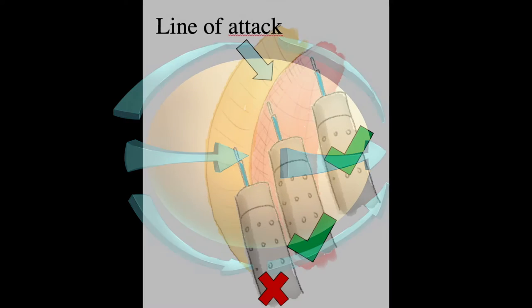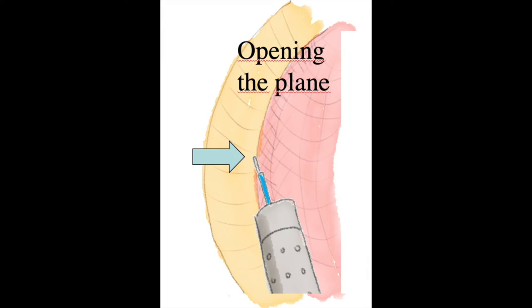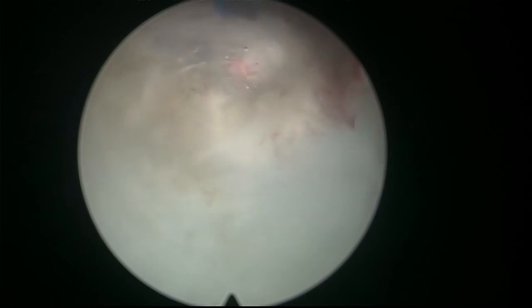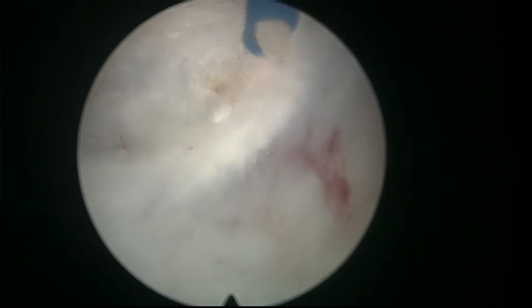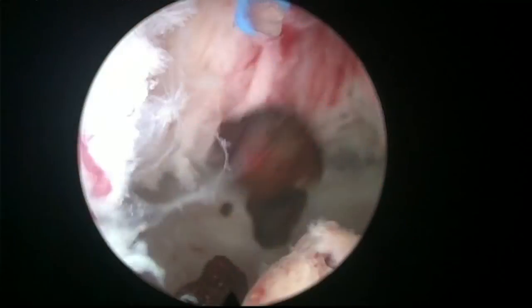We are dissecting a sphere, so initially the plane opens to the sides, opens up, opens down — then you have to close these planes. Initially we fire towards the line of attack, and when we need to close the plane we fire more against the adenoma. Firing against the line of attack will open the posterior plane. You don't want to fire against the capsule — you just want to fire along the line of attack.